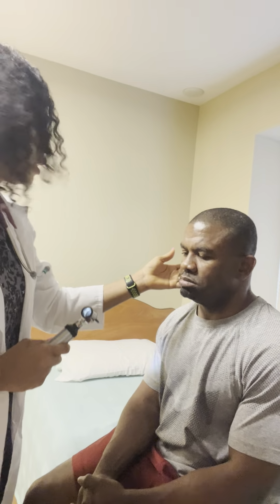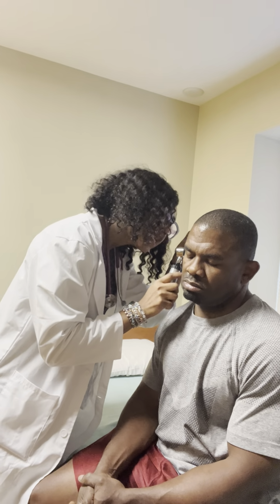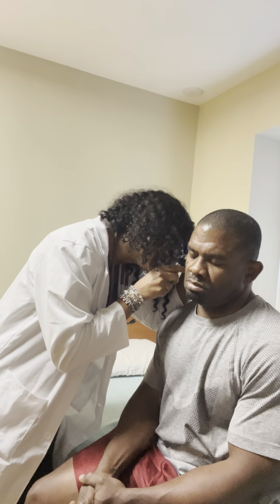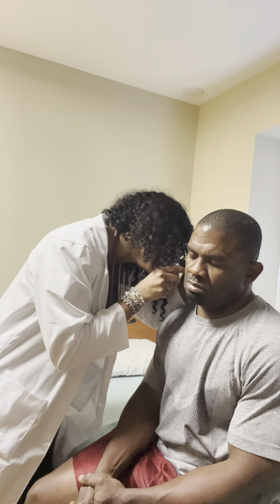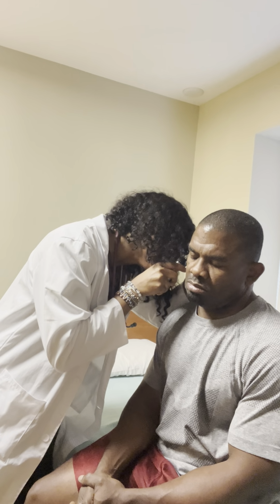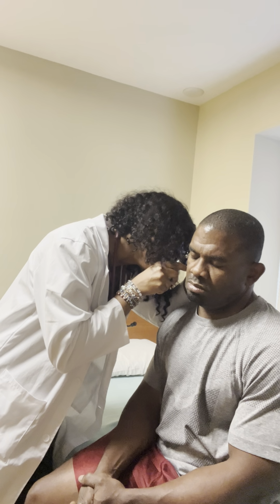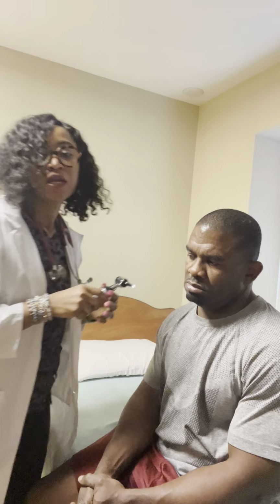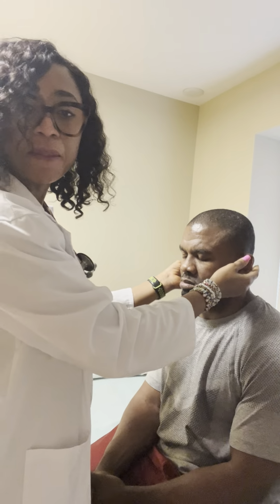And I will do the same on this ear. I will pull it up and back, and I'll be checking the external auditory canal. I don't see any redness, no drainage, no swelling, and I don't see any discharge. The tympanic membrane is pearly gray, and there's no fluid or effusion in the middle ear. And both are intact. Next, I'll be palpating the pinna.